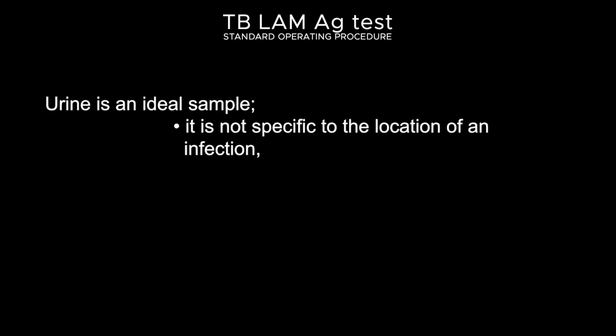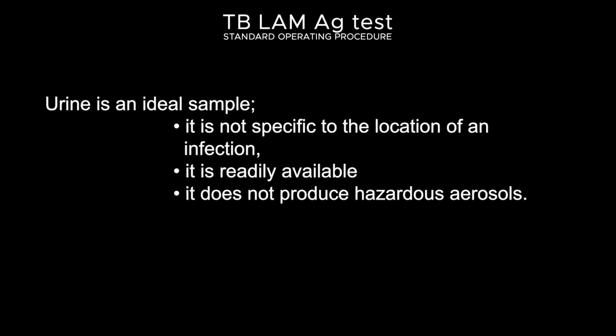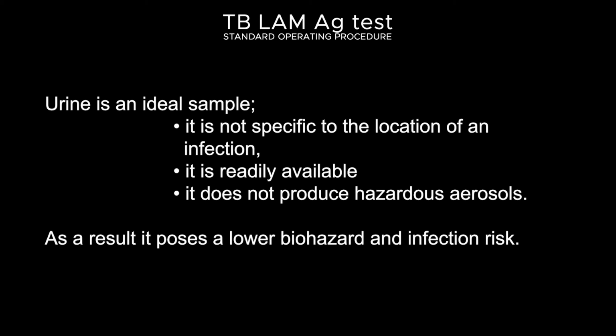Urine is an ideal sample as it is not specific to the location of the infection, it is easily available, and it does not produce hazardous aerosols. As a result, it poses a lower biohazard and infection risk.